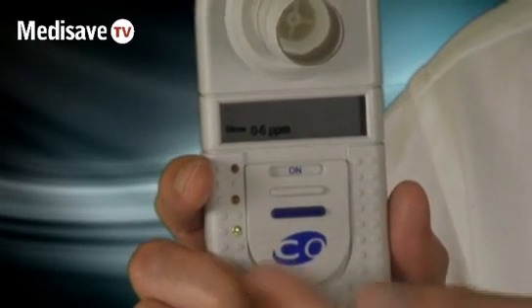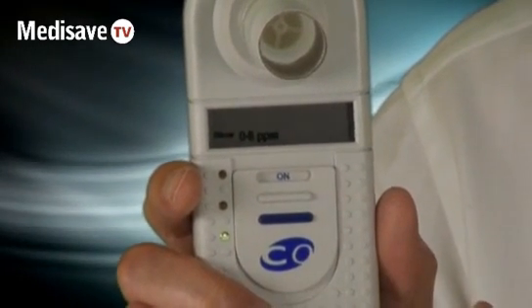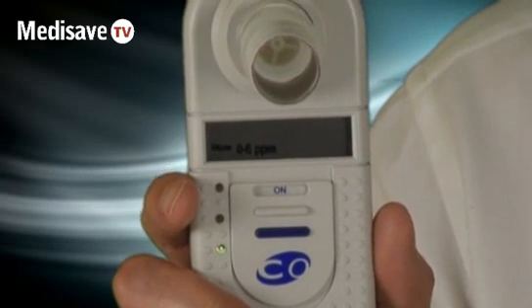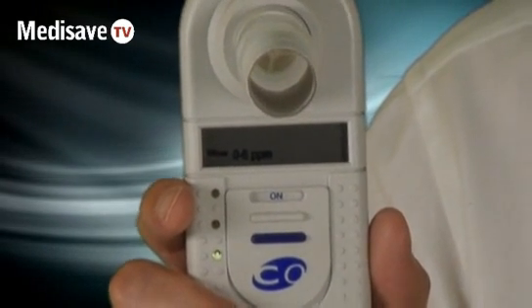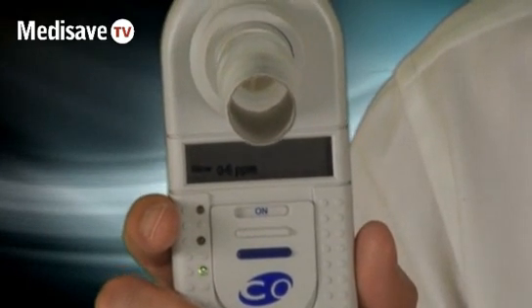The device will wait a couple of seconds to calculate, but you can see it's coming up with a green light, and it's telling me that my parts per million for CO are between 0 and 6. There's a chart that comes with it that you can reference in your smoking cessation clinic to determine whether they're a non-smoker, light smoker, etc.